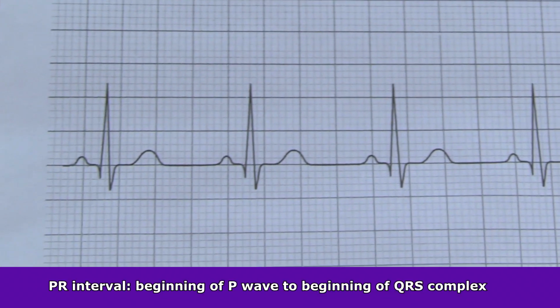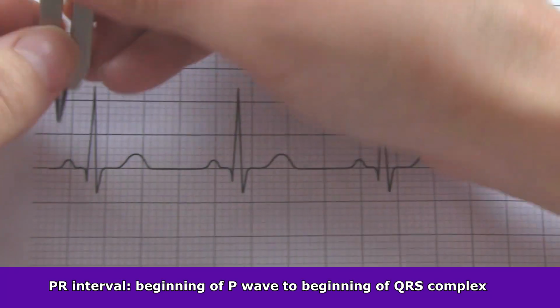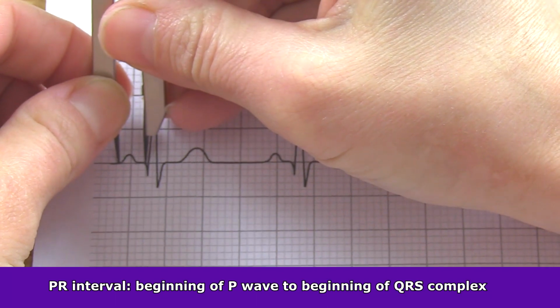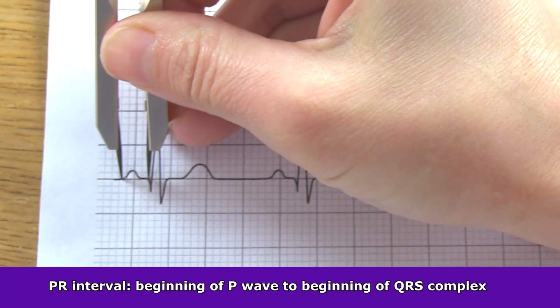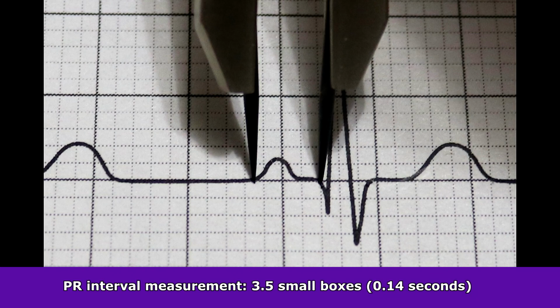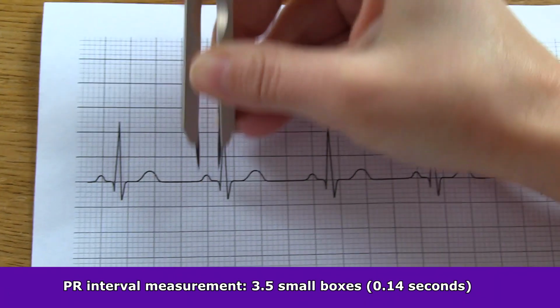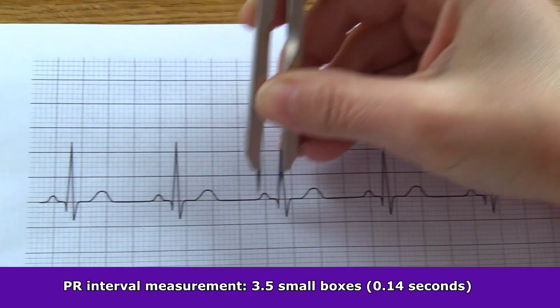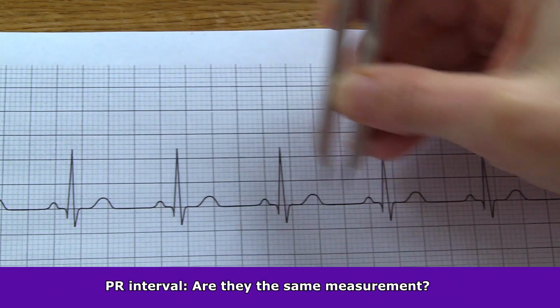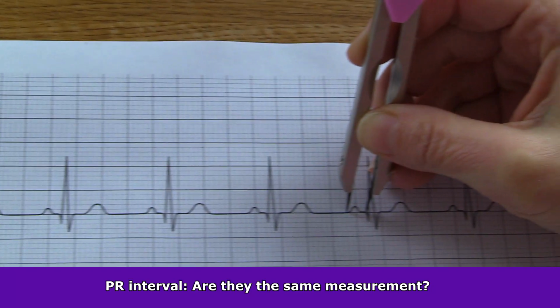So let's look at that PR interval. Again, you measure that by going from the beginning of the P wave to the beginning of the QRS complex and measuring out the boxes. Here we have about 3.5 boxes, so it's 0.14 seconds. Then you just want to go throughout your strip and measure that and make sure that all your PR intervals line up to be that same measurement.